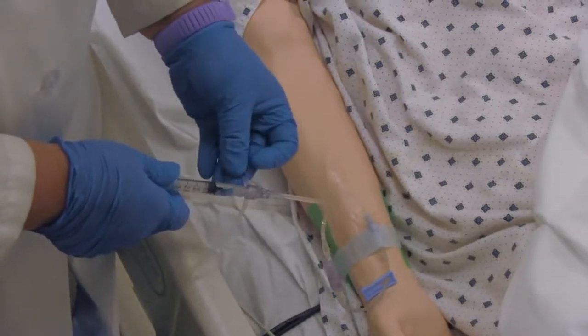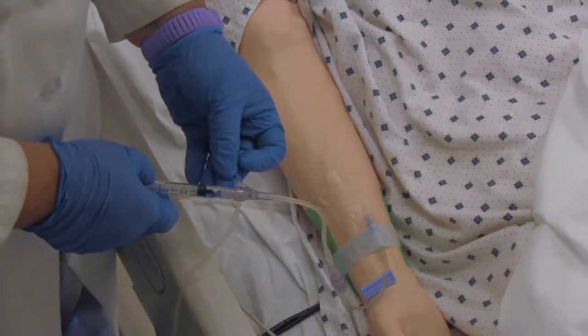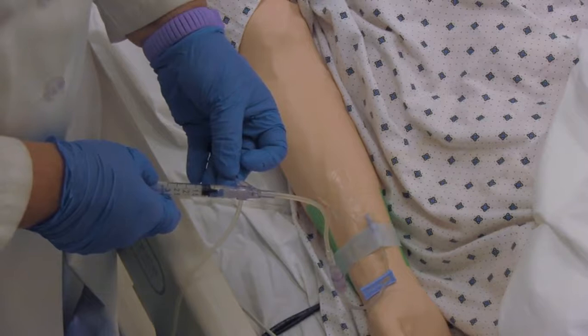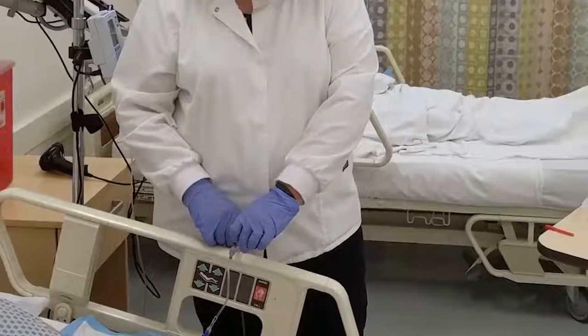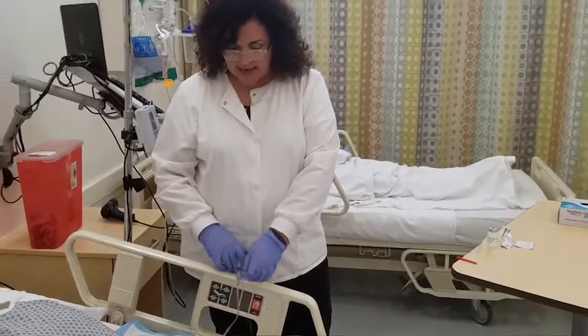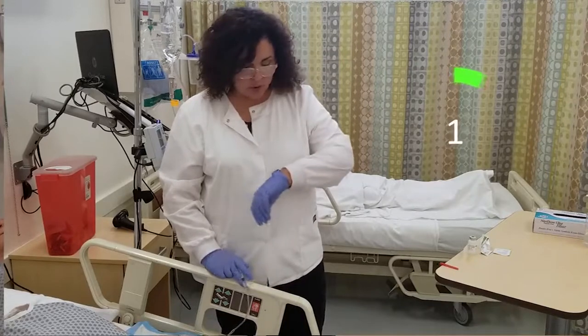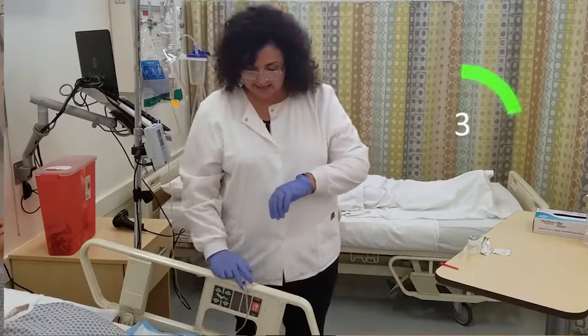So now, looking at the second hand of our watch, we're going to go ahead and give the first increment, which, remember, in this instance is 1/4 of a milliliter. So we push in 1/4 of a mil, and now we're going to release the tubing, and we're going to wait 15 seconds.